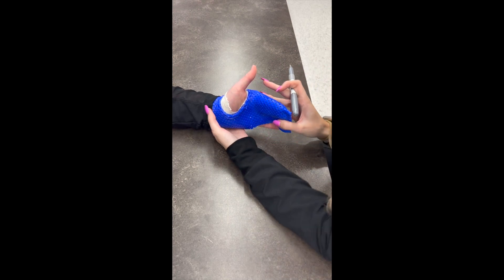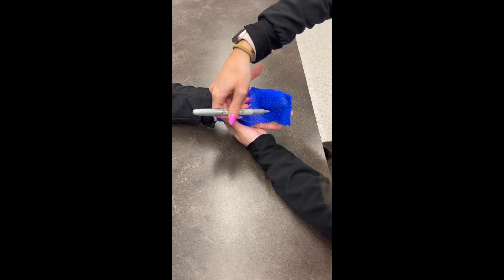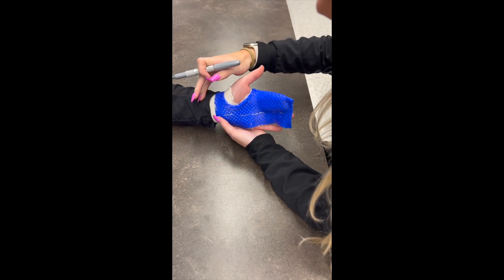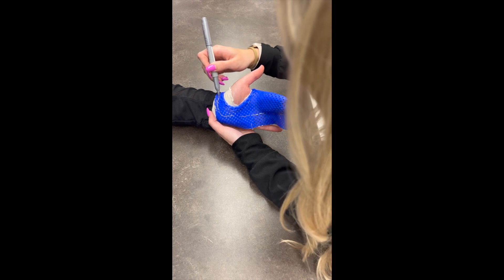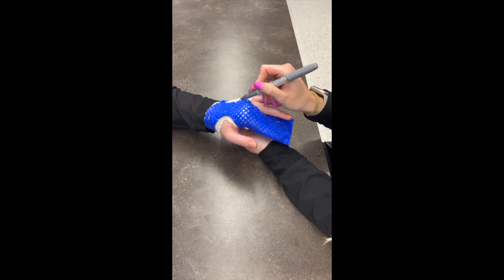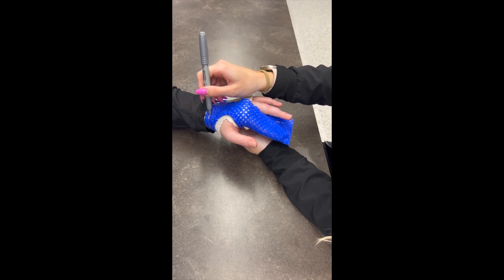Once the material is cool and you're ready to mark where you want to trim, bring it straight down between the fingers that are included and those that are not, down to the base of the thenar eminence. Since this is hand-based, we want to be sure to leave the wrist free. On the back, make sure the metacarpals are covered but nothing extends past that, and bring that line straight down as well.